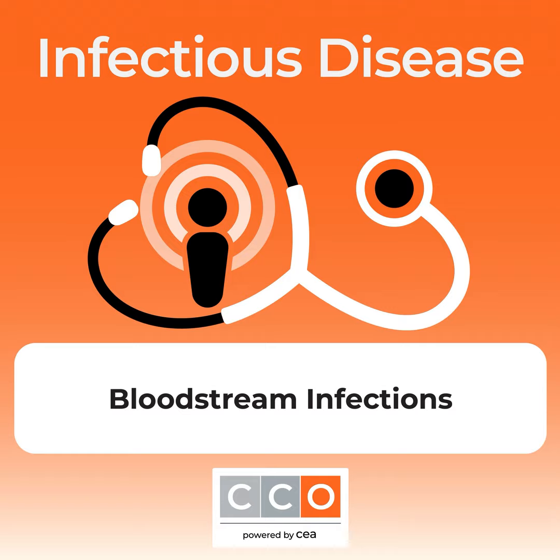When a blood culture is positive, a cascade of additional diagnostic tests begins, including the gram stain, the results of which are typically phoned to the team caring for the patient, and then subculturing of the blood to solid media so that the organism can be grown in pure culture. We can identify bacterial colonies and then do our antimicrobial susceptibility testing.